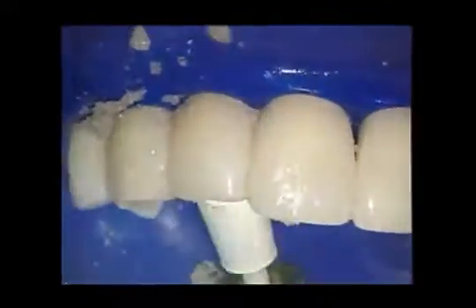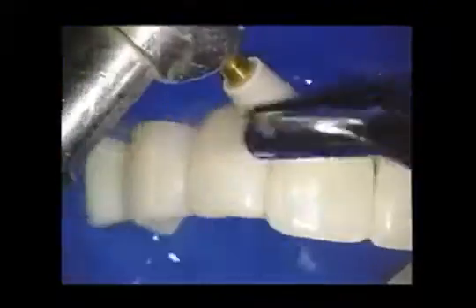The third thing we use is the jazz polisher. We're going to use a lot of heavy pressure with the jazz polisher, and I give the pressure like this. You should be able to push the patient's head down with the jazz polisher. The finer the polisher, the more pressure I use. Now, that creates a lot of heat. Once again, we've got to spray the tooth with water.